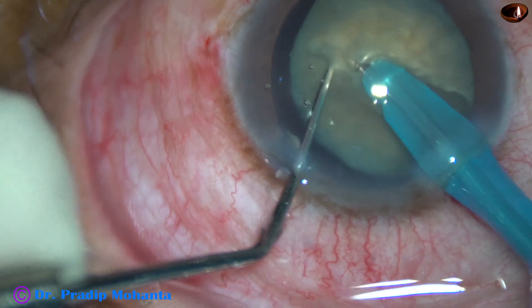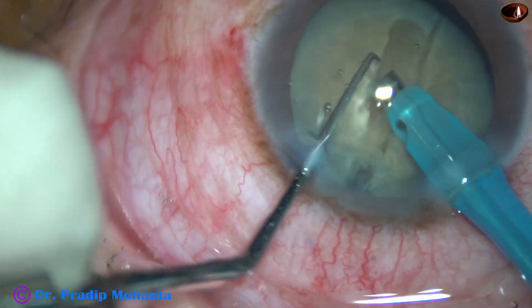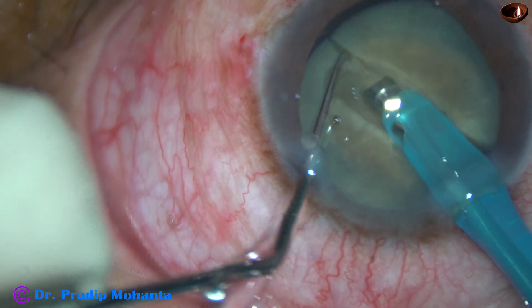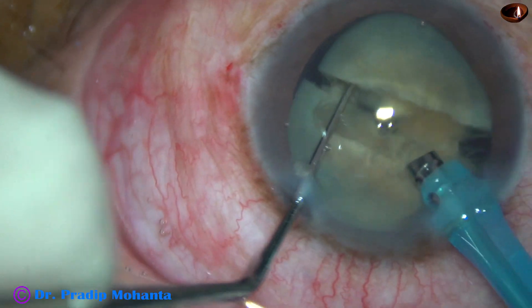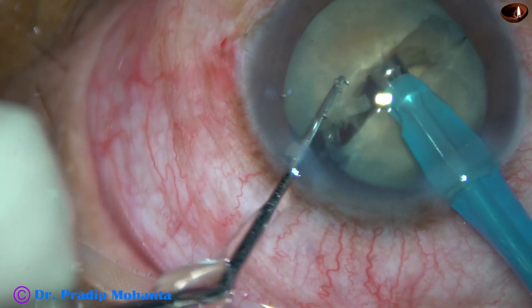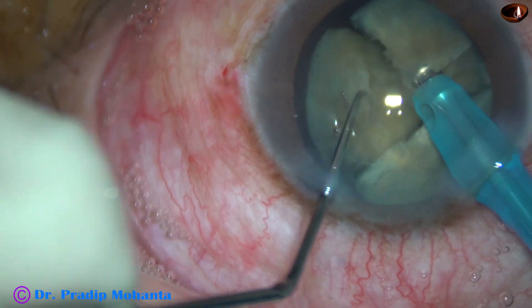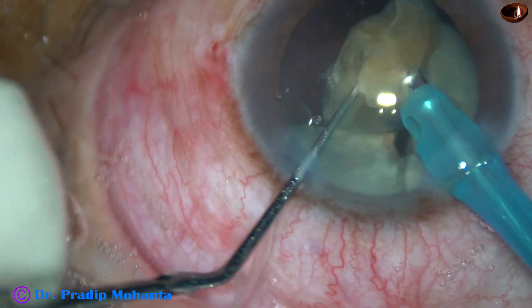And then we can divide the nucleus in this way. Unless we make the initial tunnel with bevel down, it is very difficult to engage into the nucleus. Now the nucleus has been divided completely into two halves. This is a very hard nucleus. Ultrasonic energy is 80% in continuous mode, flow rate is 45 ml per minute, and vacuum is 450 mmHg.